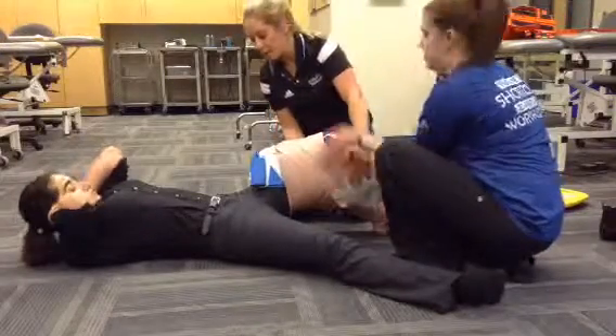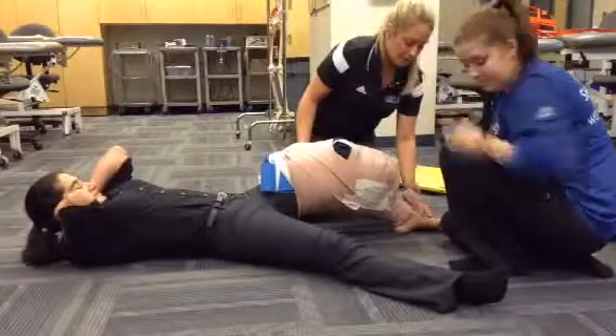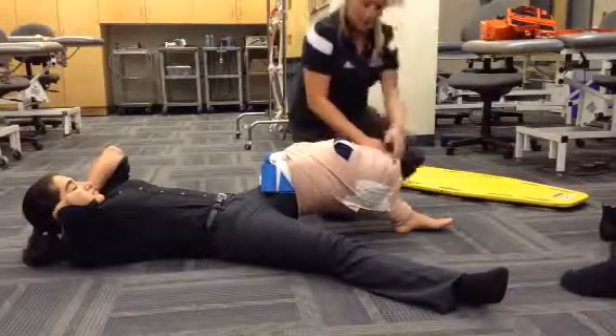Can you try to straighten your leg for me? Can you feel me touching you? Can you wiggle your toes for me? Cap refill is good.